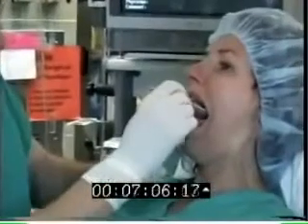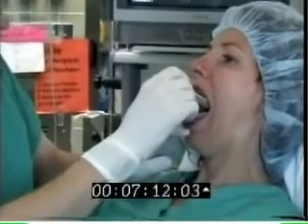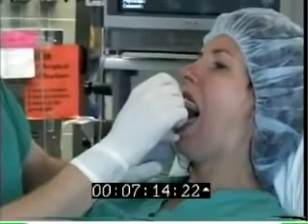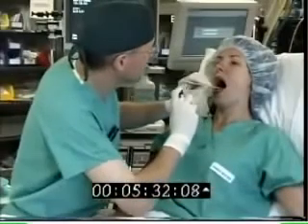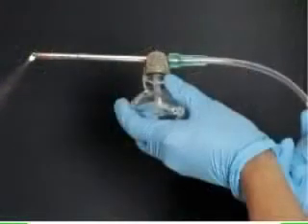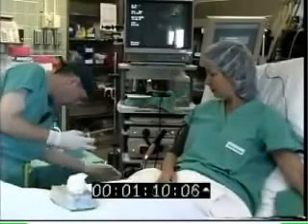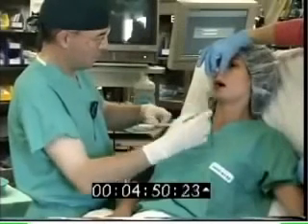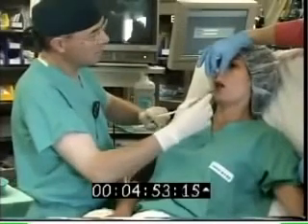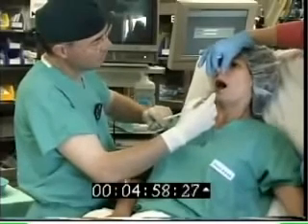If the patient cannot gargle, an alternate topical anesthetic technique should be employed by either applying 5% lidocaine ointment to the back of the tongue with a tongue depressor or using a 10% lidocaine spray directed to the relevant structures. This is followed by the use of a DeVilbiss atomizer attached to oxygen tubing with 8 liters per minute of oxygen flow. The DeVilbiss atomizer is filled with 12 milliliters of 3% lidocaine using 4% lidocaine solution diluted with water. The patient's cooperation with respiratory effort is essential while using the DeVilbiss atomizer.